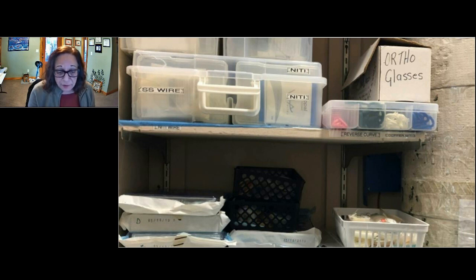I will point out that the date is on the paper on this. I don't want you to think that's the proper way to do it. That is wrong. The paper side of those peel pouches is what actually lets the steam in. The manufacturer of peel pouches will tell you, do not write anything, ever, no tape, no nothing on the paper side, because it could potentially interfere with steam penetration. And the steam has to get to every surface of your instrumentation in order for it to be effective and therefore safe for use on patients.